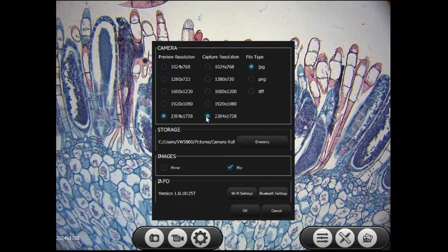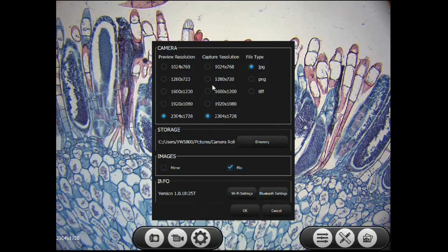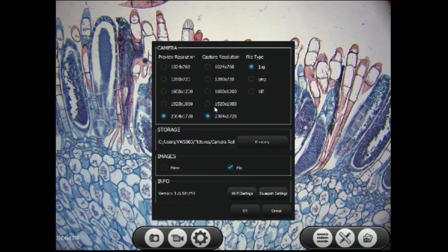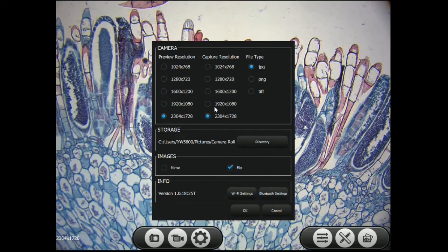The center settings are your camera resolution. The smaller the number, the lower the resolution, and the higher the number, the higher the resolution. Be careful, higher resolutions can result in large files.